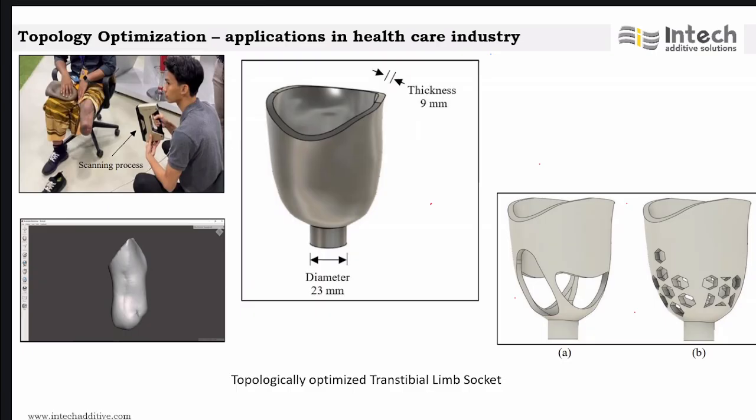So a lot of us, I'm from the software side. What challenges I will tell: we are trying to come up with customized lattice printing. So how do we come up with new sets of unit cell creations apart from the things that are available in the existing research? How do we come up with a new design? And how do we validate that? Those kinds of things.